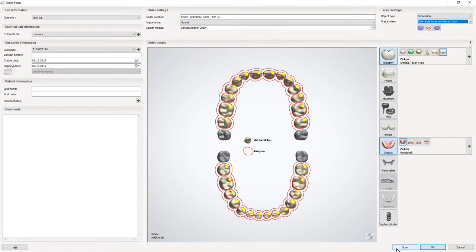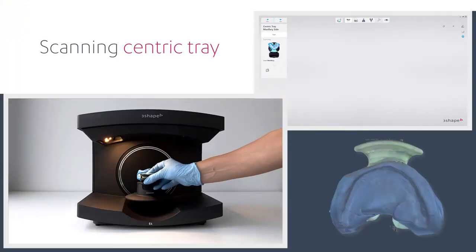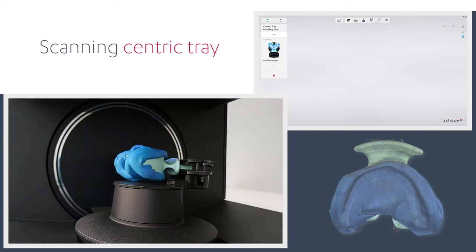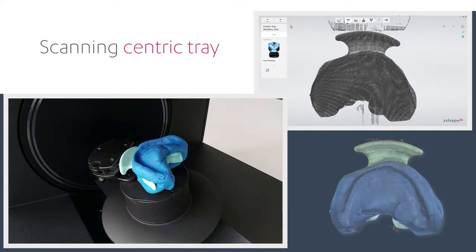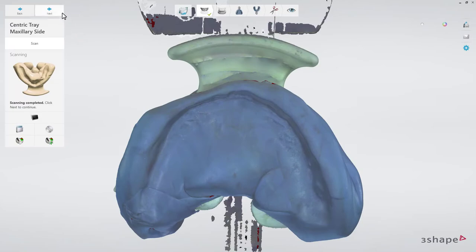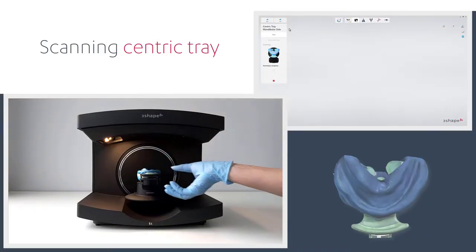Click Scan. When the Scanner Dental opens, insert the Centric Tray into the scanner as guided by the software to scan the maxillary side. Click Next to proceed. Repeat the same steps for the mandibular side of the Centric Tray.